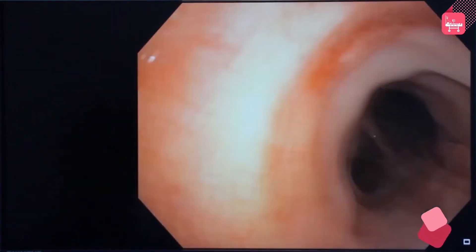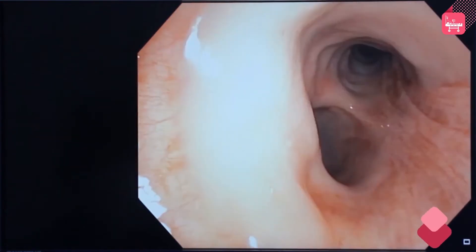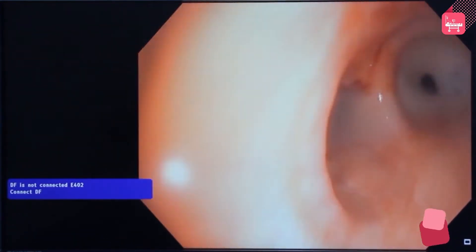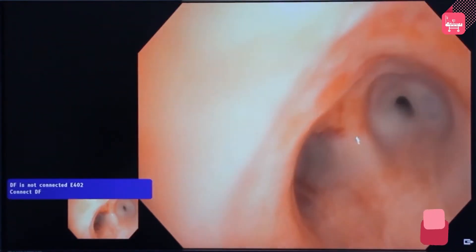This is the lower end of the tracheostomy tube. Slowly insert the bronchoscope into the trachea by visualizing the position on the monitor. Once the carina is seen, look for two visible openings, which are the right bronchus and the left bronchus.